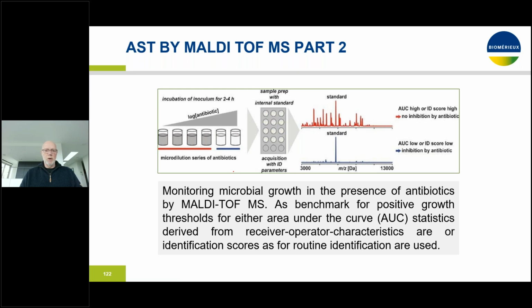One of the categories of antimicrobials that are also hydrolyzed by enzymes are the aminoglycosides. And maybe Marina has to correct me and I'm wrong, but I do not recall any paper where mass spec was successfully used for hydrolysis analysis of aminoglycosides in a reliable, reproducible, high throughput manner.